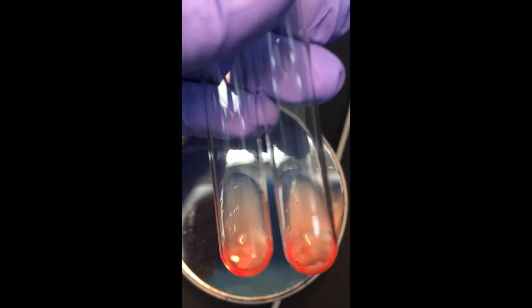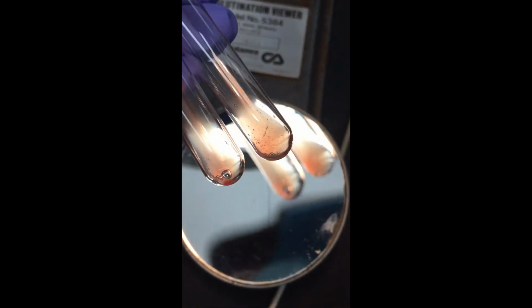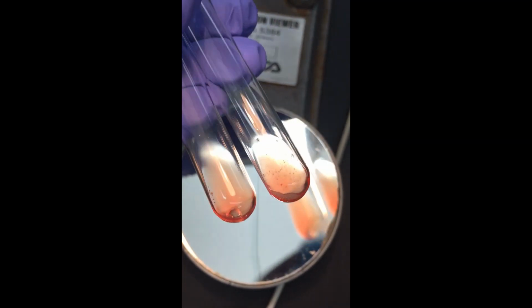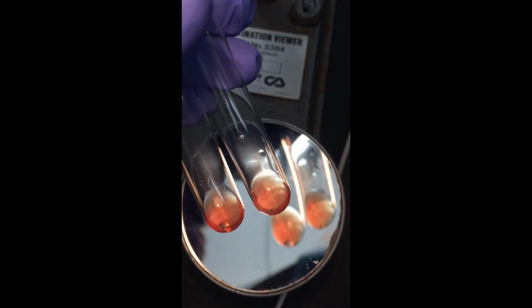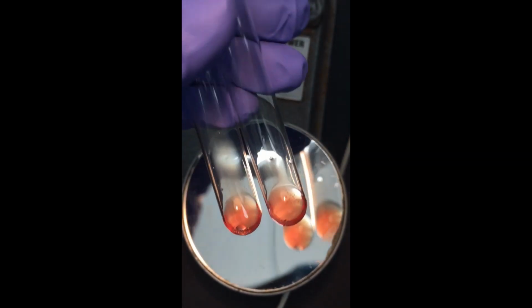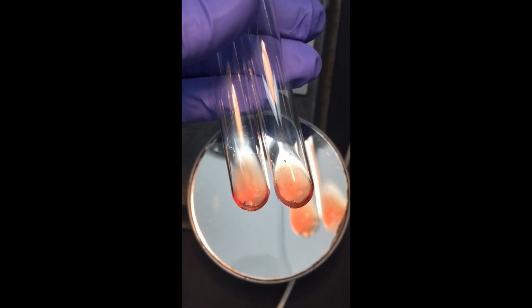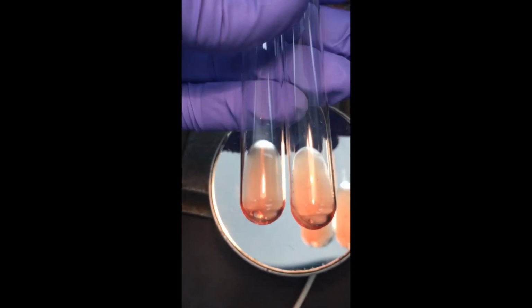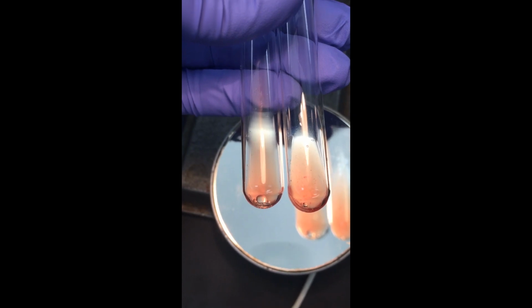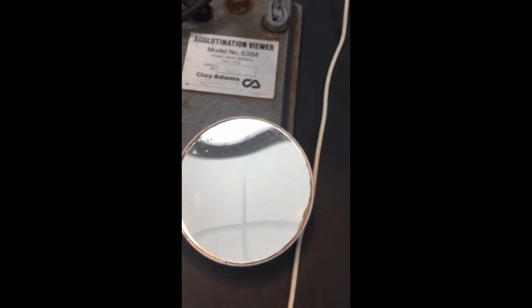Tubes 5 and 6. Remember, you're looking for this kind of swirling pattern as we cut across the cells with our liquid. And there's a bubble in there, in the tube on the left. Do not mistake that for agglutination, even though I know it's really difficult to see, versus the tube on the right. Okay, you see those patterns? All right, now I'm going to incubate these at 37 degrees for 15 minutes.